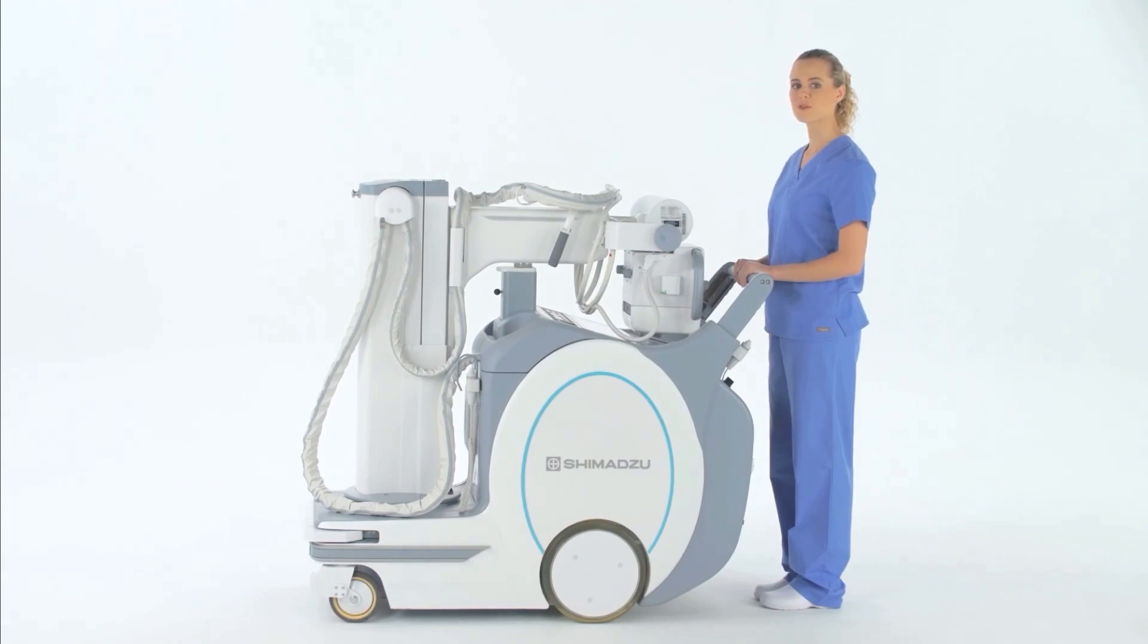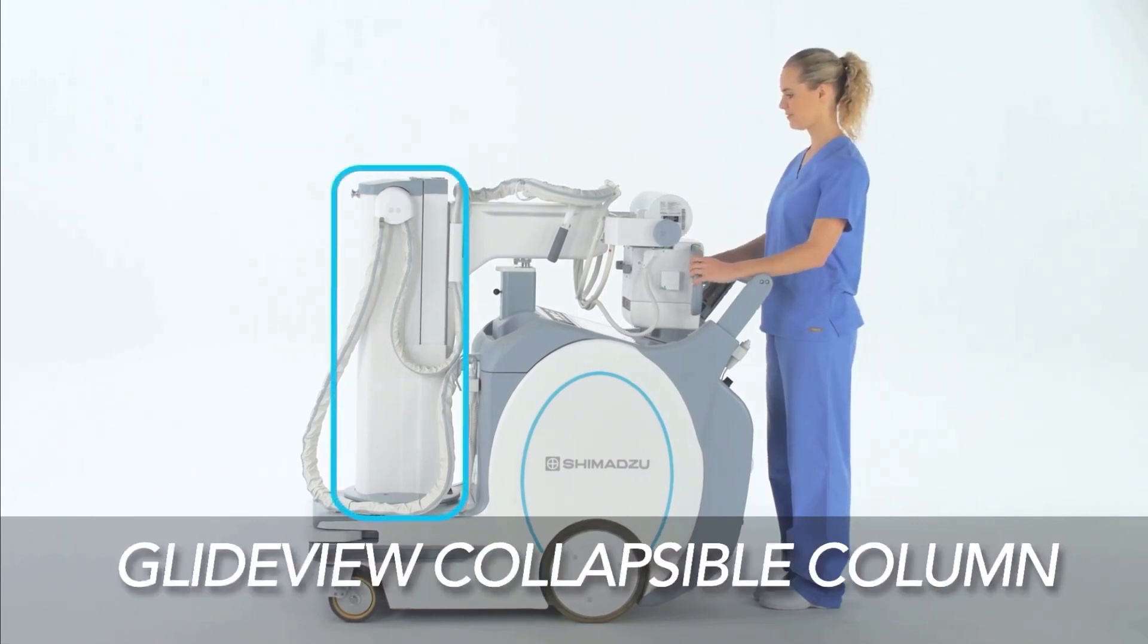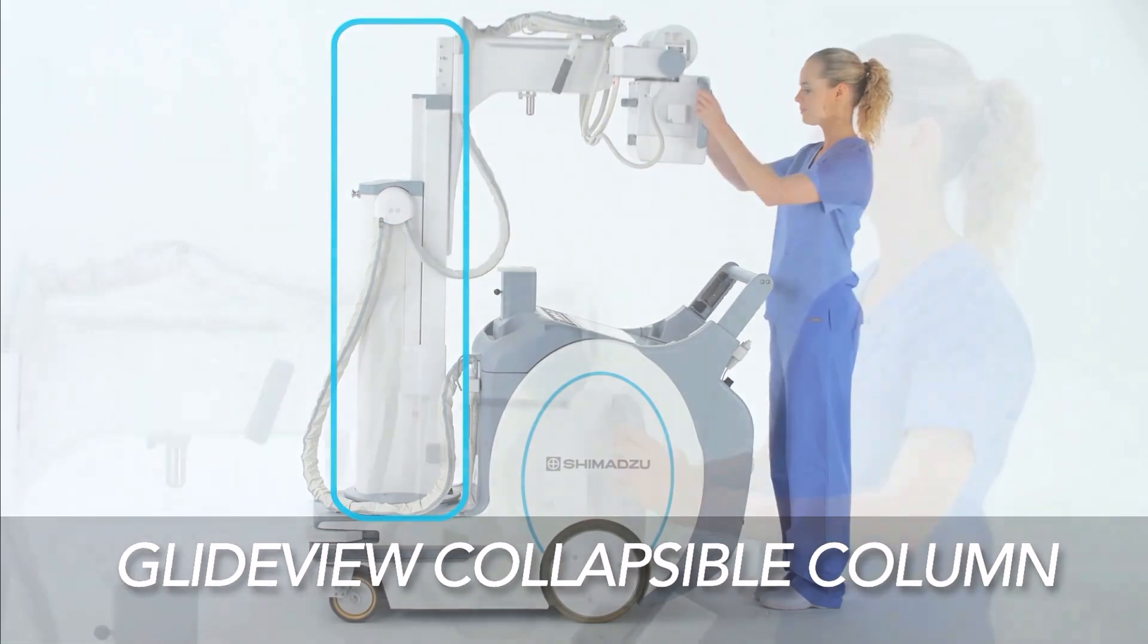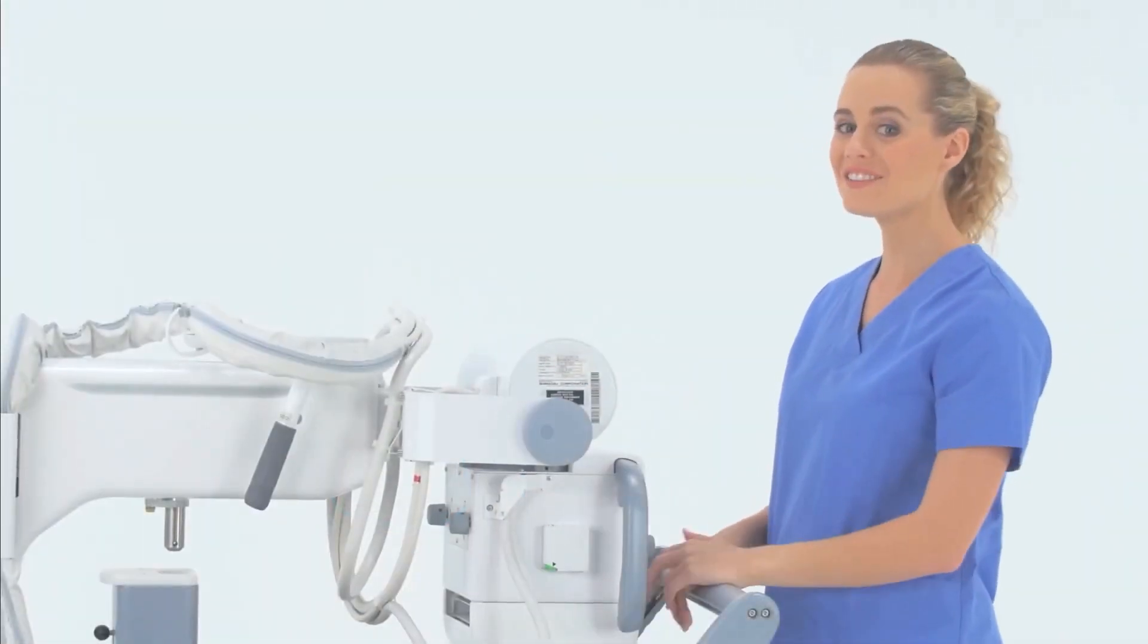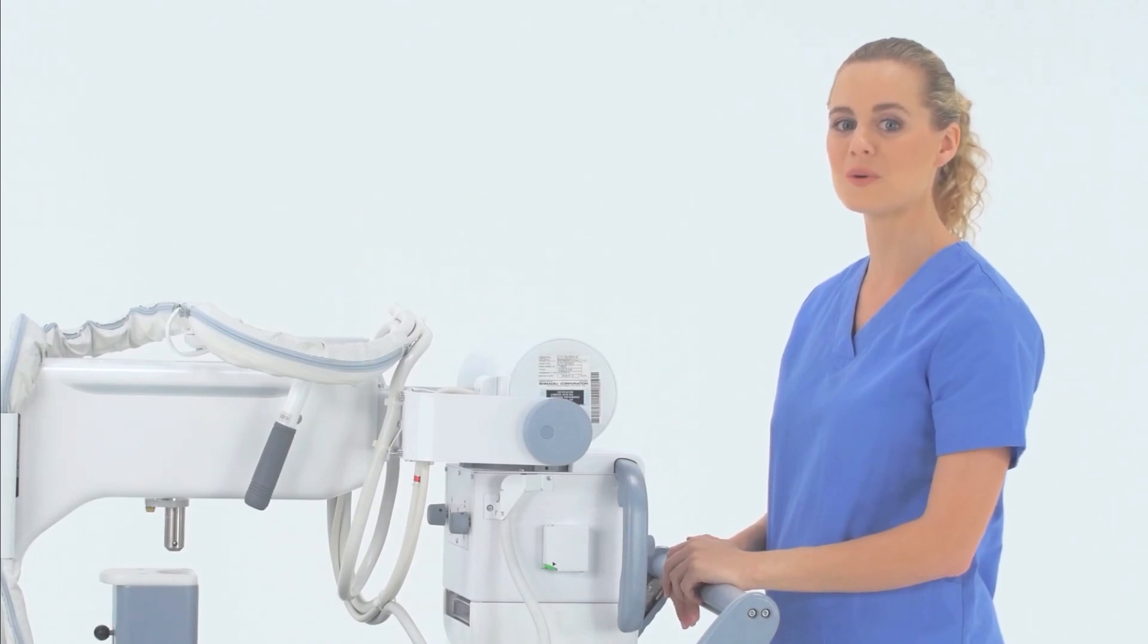One of the first improvements you will notice is the increased field of visibility over the top of the unit. This is due to the new GlideView collapsible column. Now technologists of nearly any height can enjoy a virtually unobstructed field of view when driving the unit.